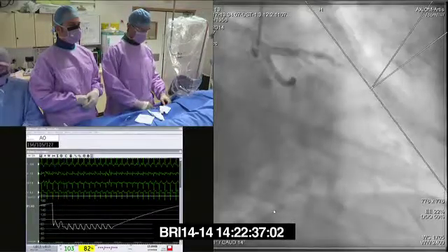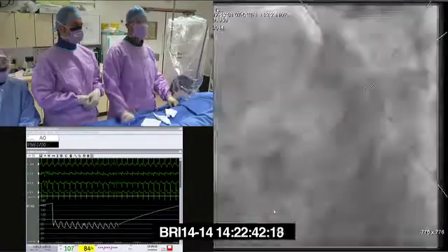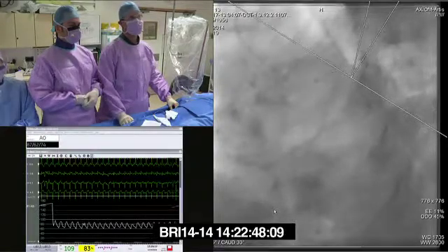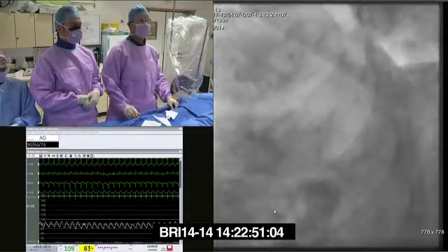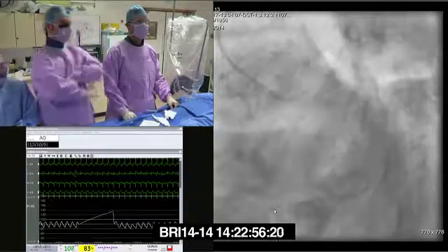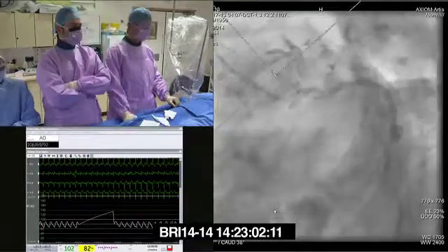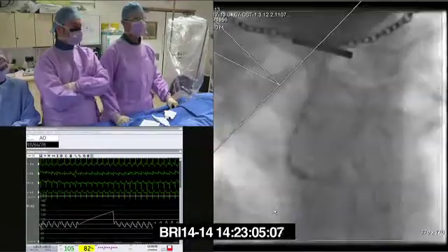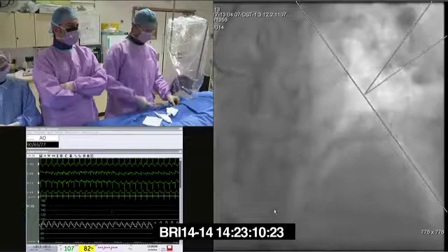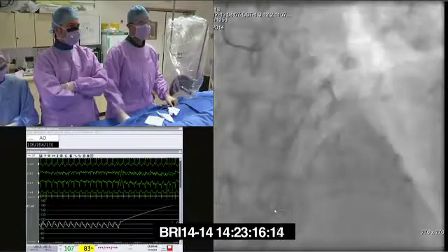Spider, please. Just a little bit more caudal, probably. That's great. And then PA coronary, please. We'll just do a long one, no panning required on this. So show us everything. She had pain 2 days ago. That's great. Just there. We'll just see that back fill.